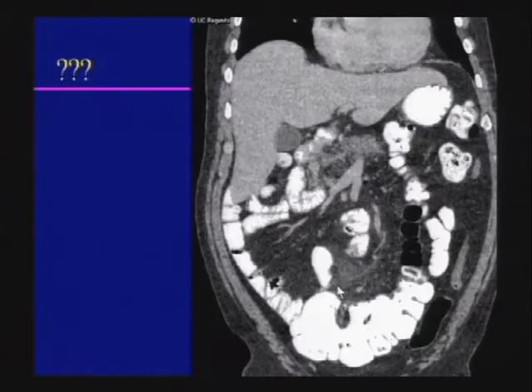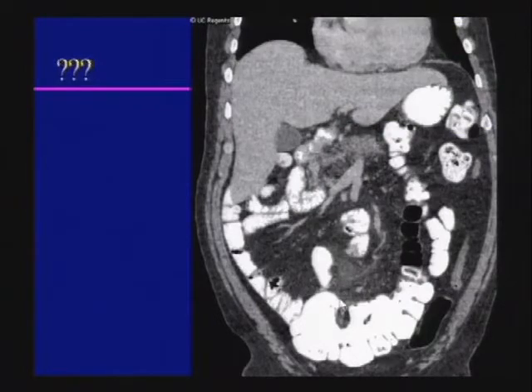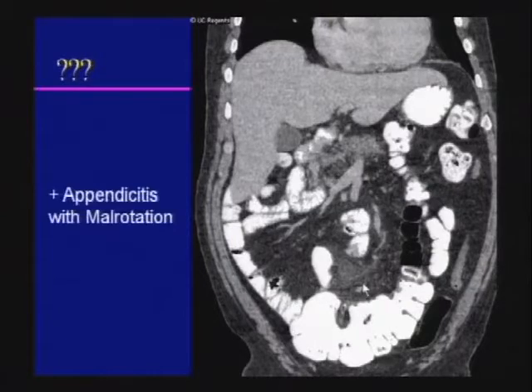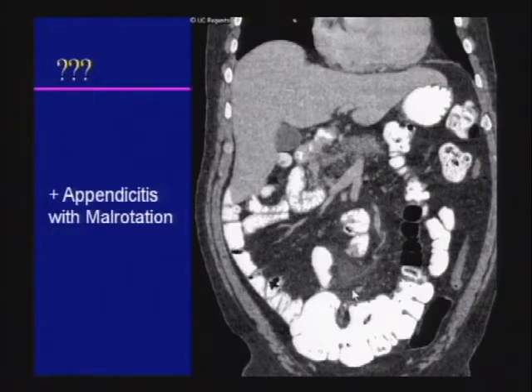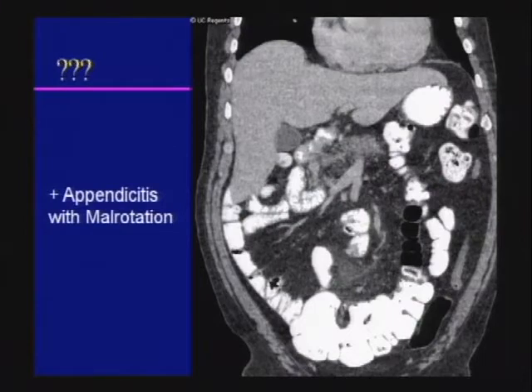You may see atypical presentations of appendicitis. In this case, there is stranding in the pelvis close to the ileocecal valve, but the cecum is malrotated and lying in the pelvis. This is a patient with acute appendicitis and malrotation. Be aware that you can have pain in the left upper quadrant or in the pelvis depending upon how the cecum is rotated, and you should look for the cecum and ileocecal valve in all cases of appendicitis.